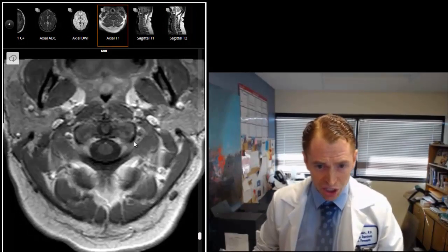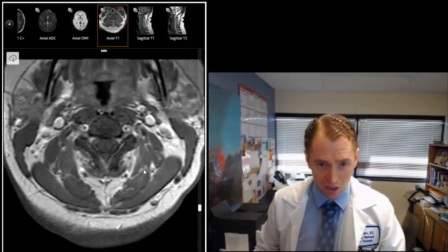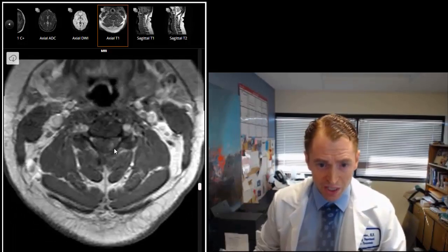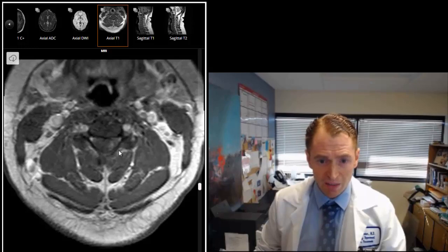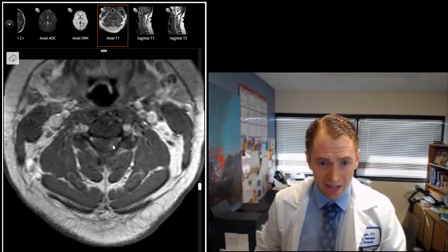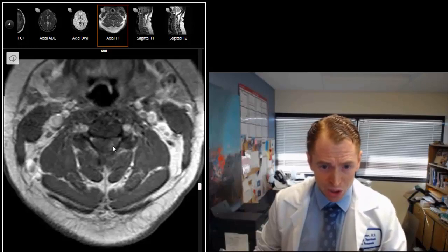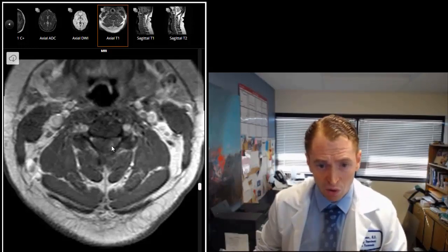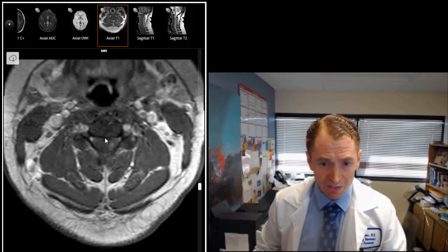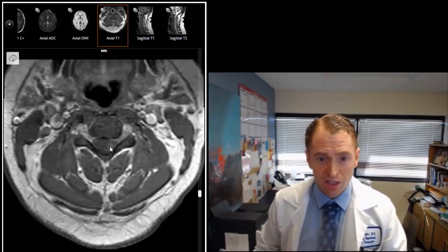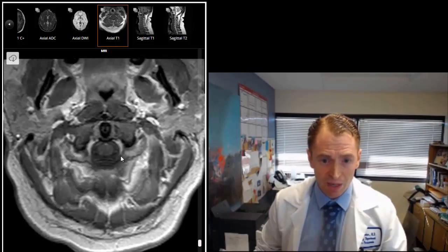This is an axial T1 scan with contrast dye. You can see this is an enhancing lesion on the left side of the spinal cord. This could cause numbness and weakness of the left side of the body. It turns out that the more of the sensory fibers involved in vibration and fine touch are more towards the back. The motor fibers and the fibers involved in pinprick and temperature sensation are more towards the outside or lateral part of the spinal cord. In the front are the motor neurons. So this person could have weakness and numbness on the left side of the body.